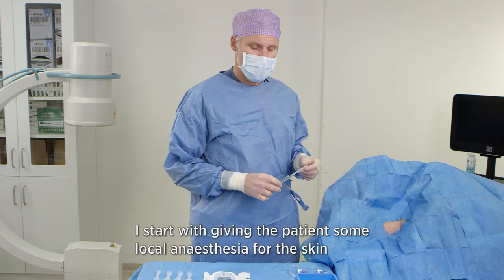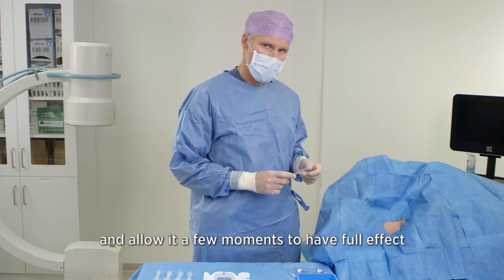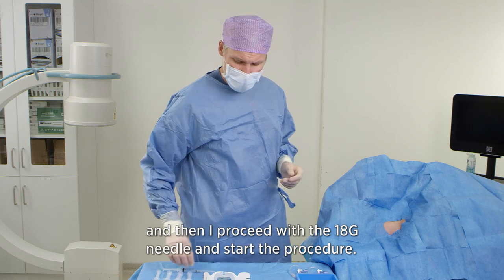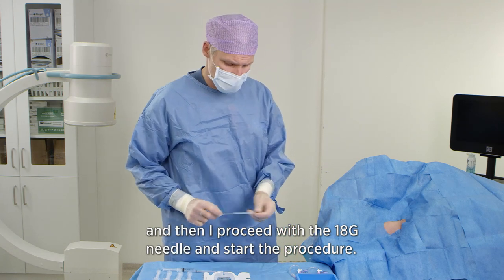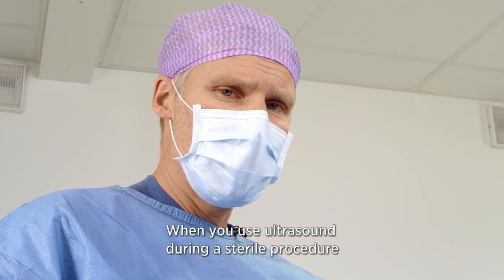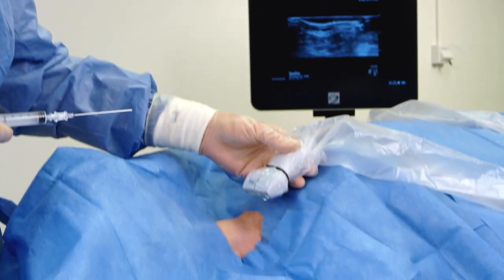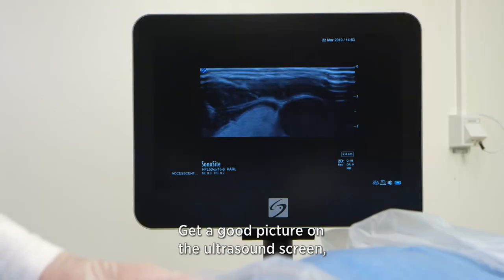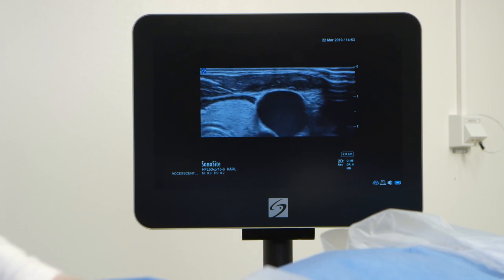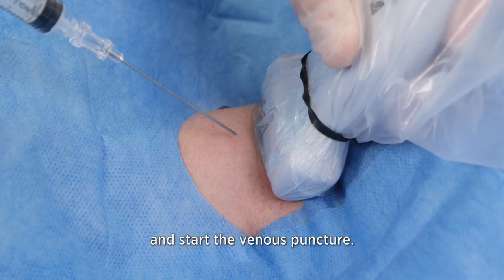I start by giving the patient some local anesthesia for the skin and give that a few moments for the anesthetic to have full effect. Then I proceed with the 18 gauge needle and start the procedure. When you use ultrasound during a sterile procedure, make sure you cover the probe with a sterile sleeve. Get a good picture on the ultrasound screen and identify the vein before starting the venous puncture.